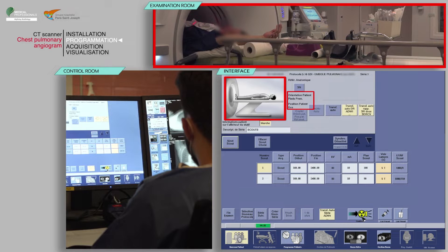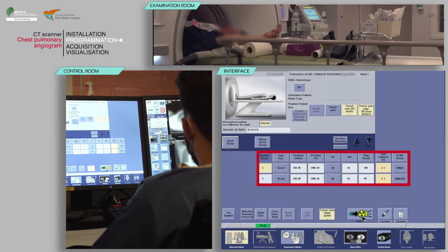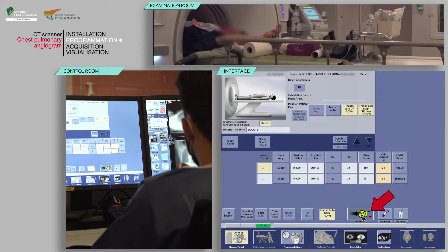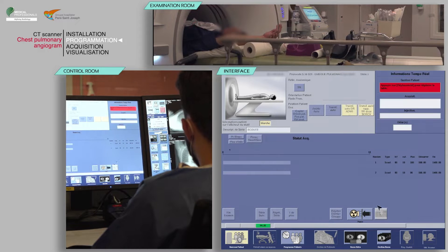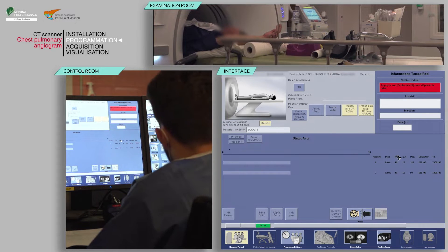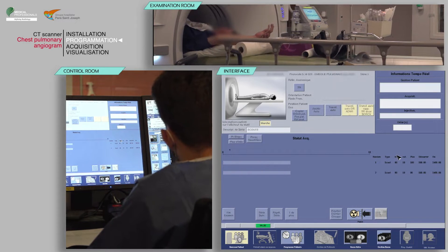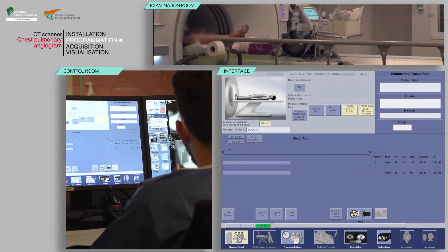Since this is pre-loaded, if you have the patient head first, you would need to make that change here. After verifying the scan parameters, click Confirm. On the keyboard, move the table and initiate the acquisition when the buttons flash.